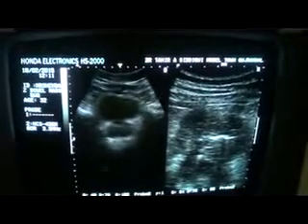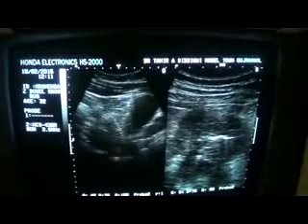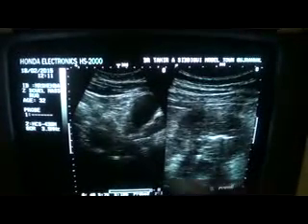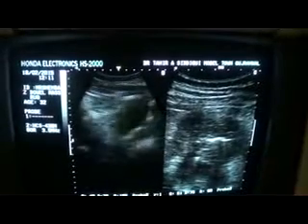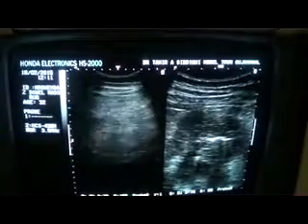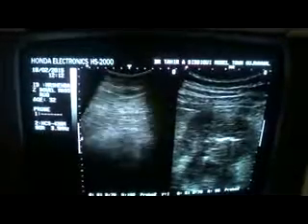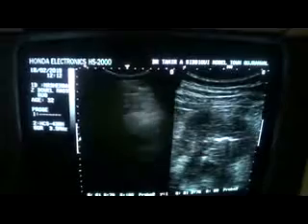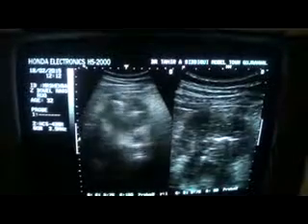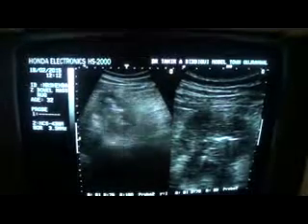This is the urinary bladder and the prostate. This is the urinary bladder, prostate, and this is the longitudinal view. No ascites is seen. This was to see if there is any dependent fluid. The longitudinal view should always be taken and a sweep given with the probe in all abdominal quadrants to see if there is any other satellite lesion or any other mass in any other quadrant of the abdomen. We do not see that. We see it only here. Now the liver, it does not relate to the liver.